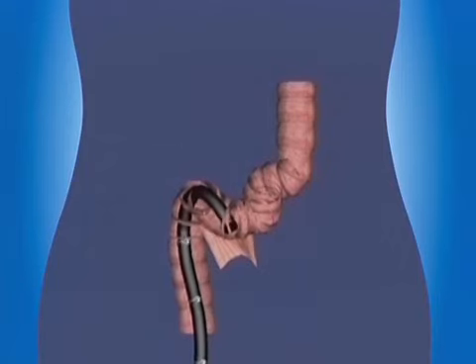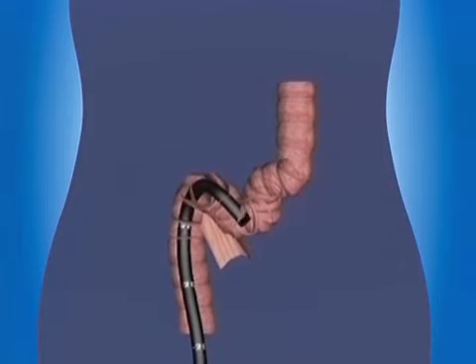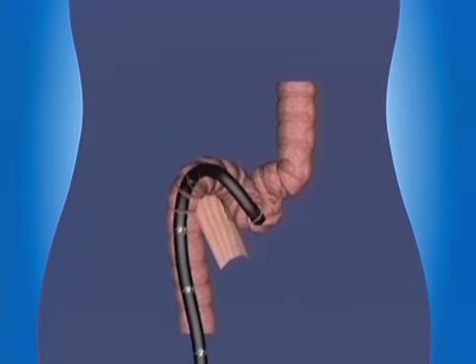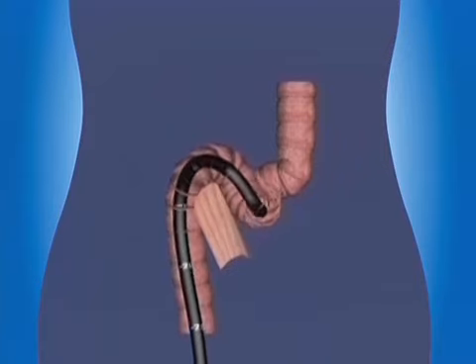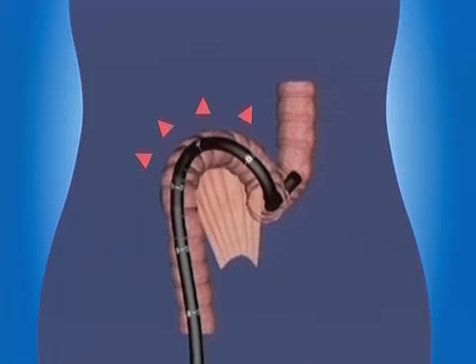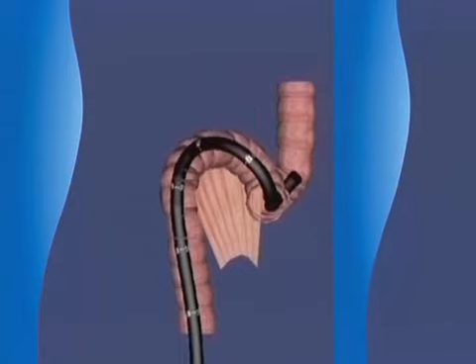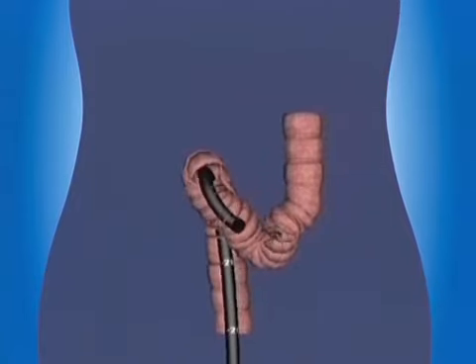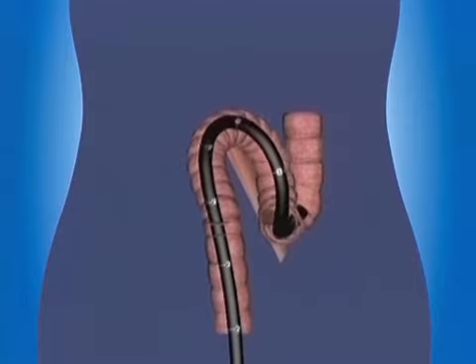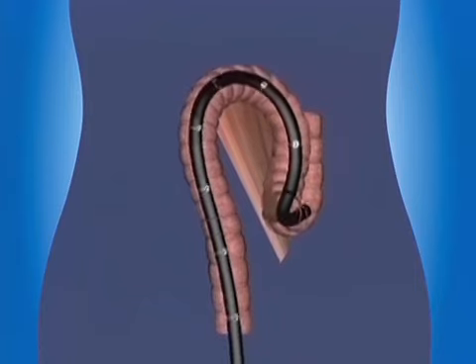How much the sigmoid can loop depends on the length of the sigmoid mesentery or mesocolon. When this is short, colonoscope insertion will activate stretch receptors in the bowel wall and mesentery and cause pain, especially in young patients with an irritable bowel. By contrast, a very long and mobile sigmoid, such as this, may loop amazingly, but with no pain because the long colon isn't unduly stretched.